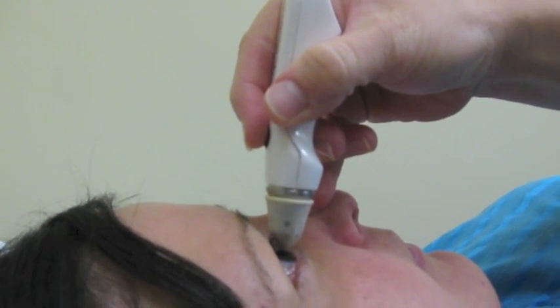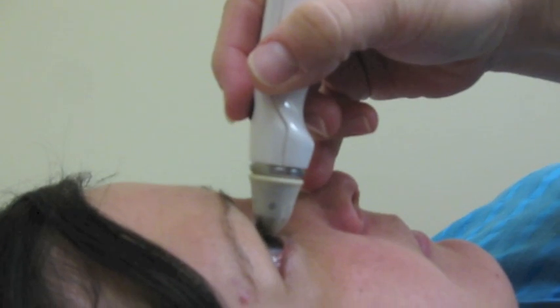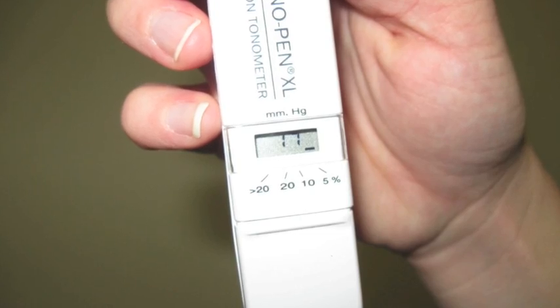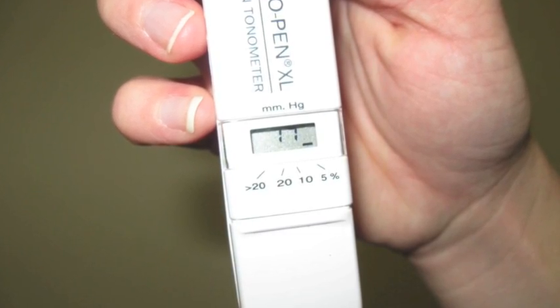Follow the manufacturer's steps to calibrate the tonometer until the word 'good' appears in the window. Hold the device steady with your fingertips and gently touch the surface of the cornea. The transducer of the device will measure the eye's resistance to indentation; you will hear a clicking sound each time a reading is obtained. When three accurate readings have been obtained, a beep will sound and the device will display the intraocular pressure measurement.